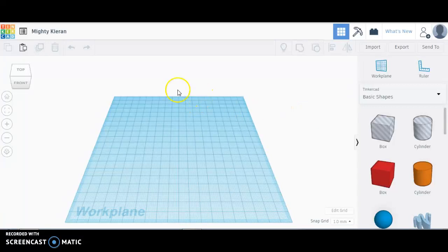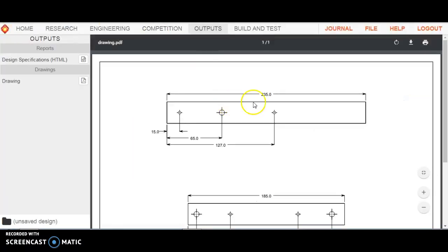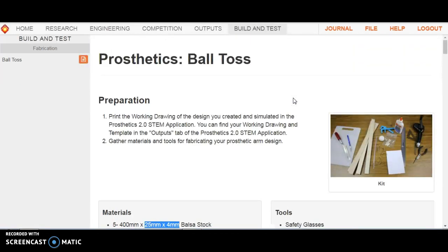Hi, this video is to show how to use TinkerCAD to design parts of the Whitebox Prosthetic app for 3D printing. So I'm going to need in Whitebox to have my engineering drawing open. That's under Outputs, Drawings. And I'm also going to need to refer often to the Whitebox Build and Test instructions.